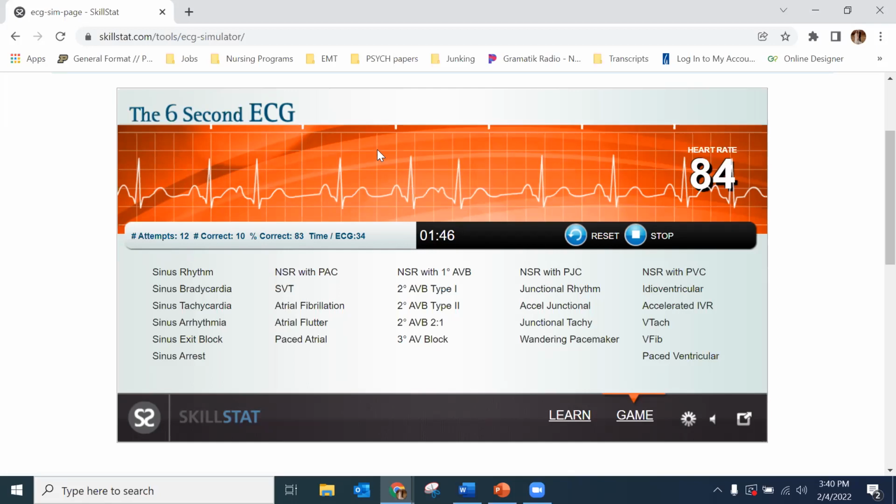Same thing, it looks like this thing wants to be normal. So you're like, what is going on here? If I go from these three right here, spread out pretty easily, my PR interval looks good. My rate is okay, but it's beat number 3, this one right here, and then this one at the end, those are premature atrial contractions.